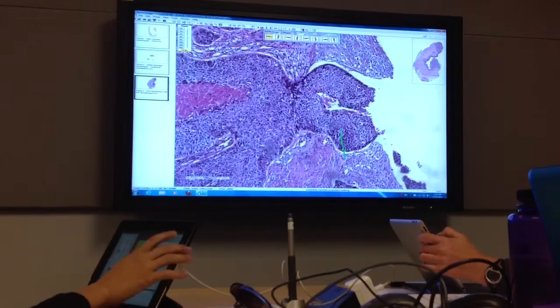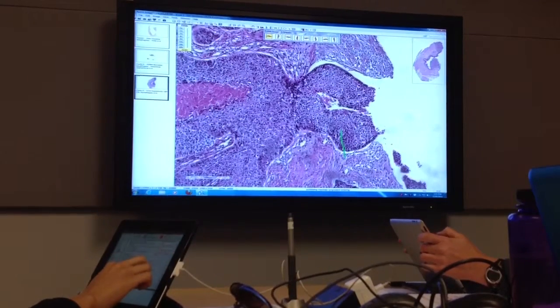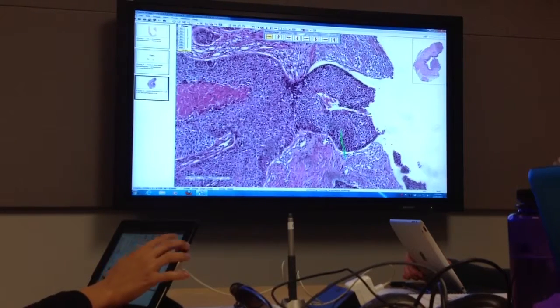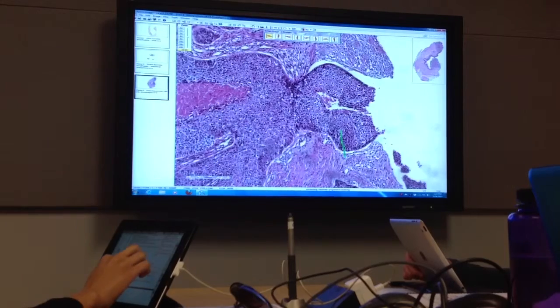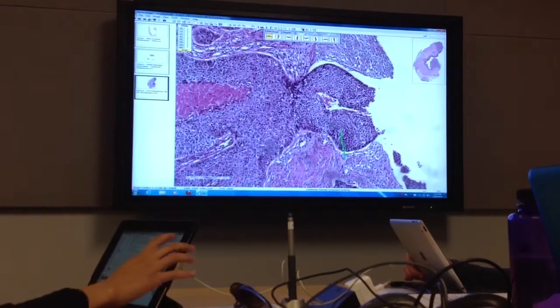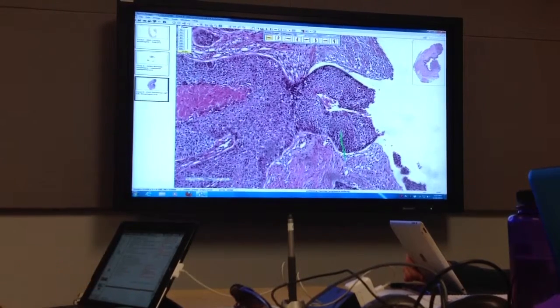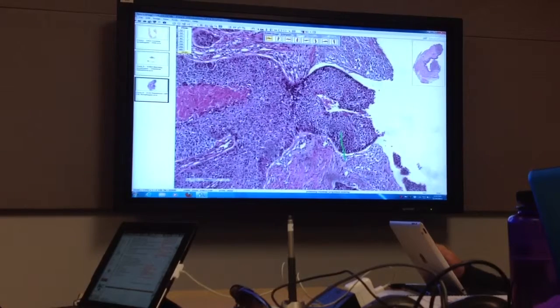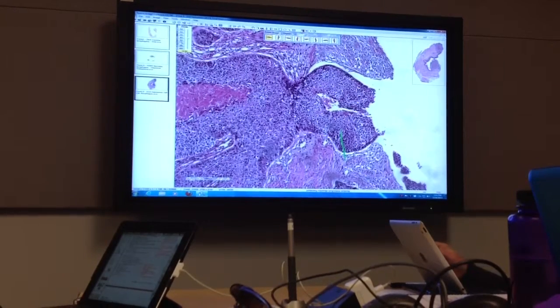If you have the full thickness of the squamous mucosa very atypical like we saw, it's high-grade dysplasia, but you can have it if it went up like two-thirds, that would be high-grade dysplasia. If it's the full thickness, it's carcinoma in situ. But if you look at the cells, they look exactly the same. It's clonal. And some people do use them interchangeably. But they're both precursors to invasive carcinoma. Good questions.